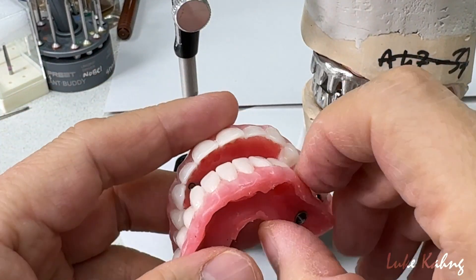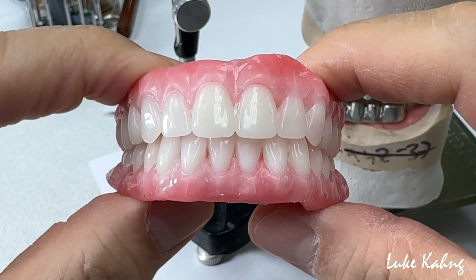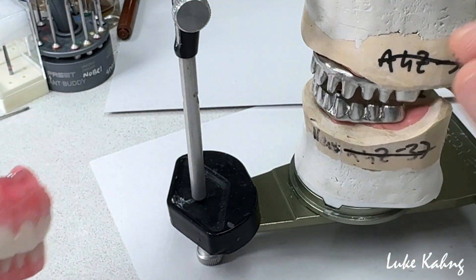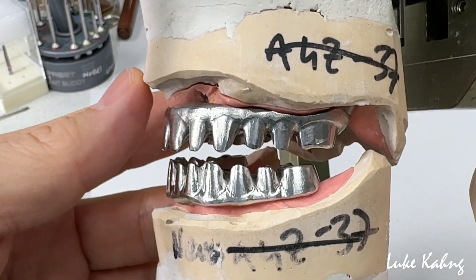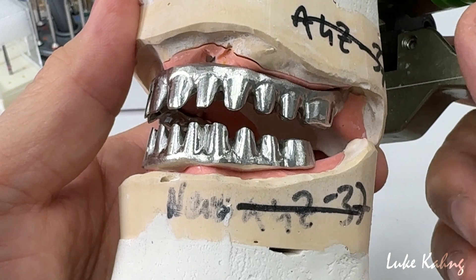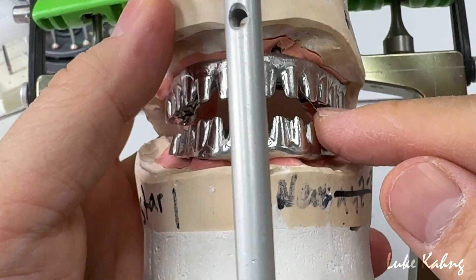This is what I previously showed them — to make this perfect and beautiful. Try and set up. Now we are almost done; I have to modify a little here and there. Pretty good. About 4-5mm room, so we make it monolithic.